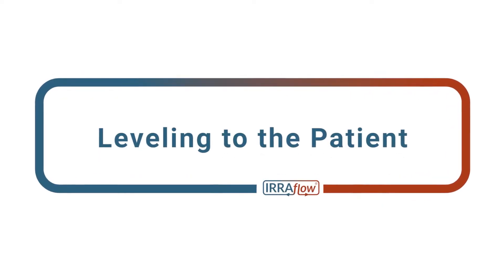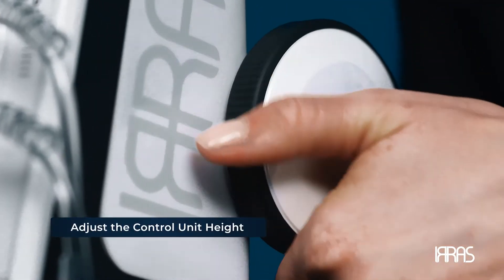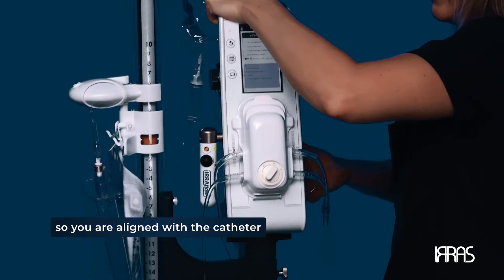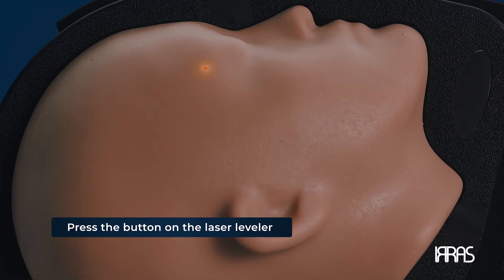Chapter 4: Leveling to the patient. You have now successfully set the airflow control unit up and are ready to adjust the control unit height so that you are aligned with the catheter. This will ensure you are obtaining an accurate ICP reading. To do this, press the button on the laser leveler to shoot a laser beam over to the patient.